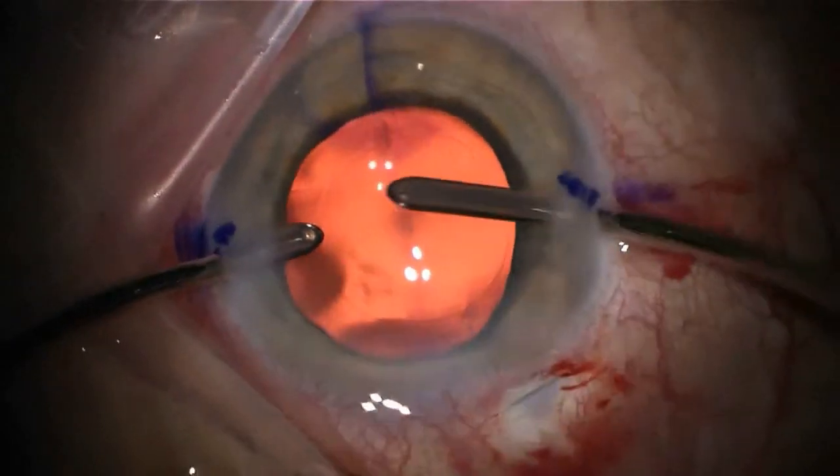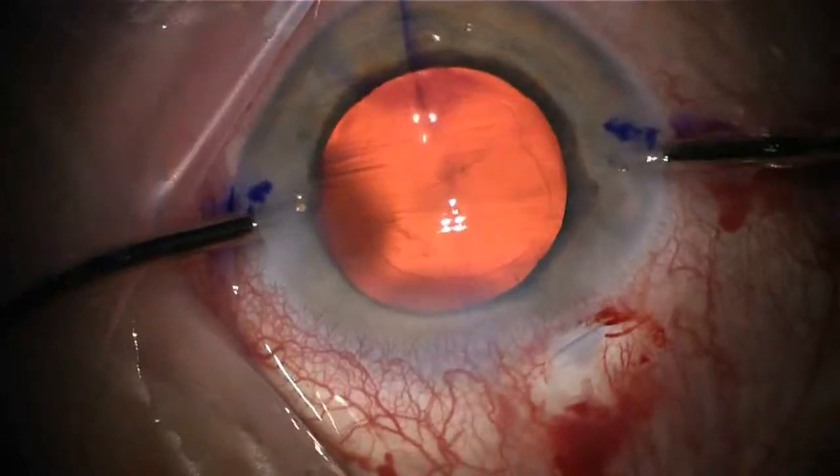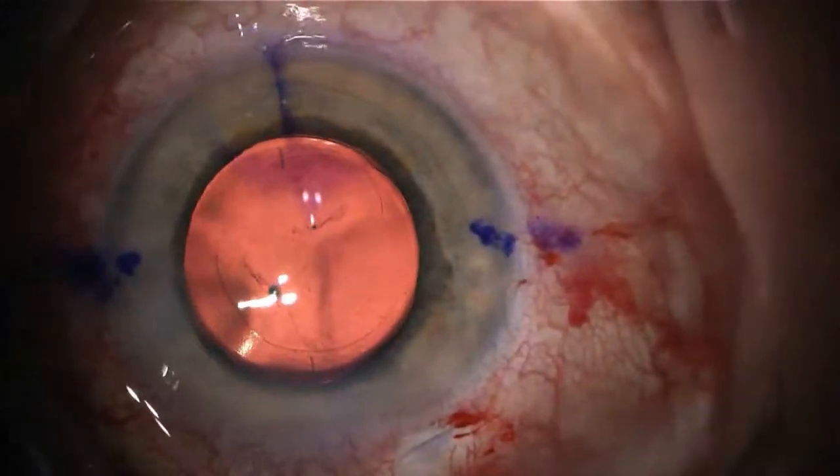The surgeon may gently compress the IOL to the back of the capsular bag to ensure the IOL remains in its final position following surgery.